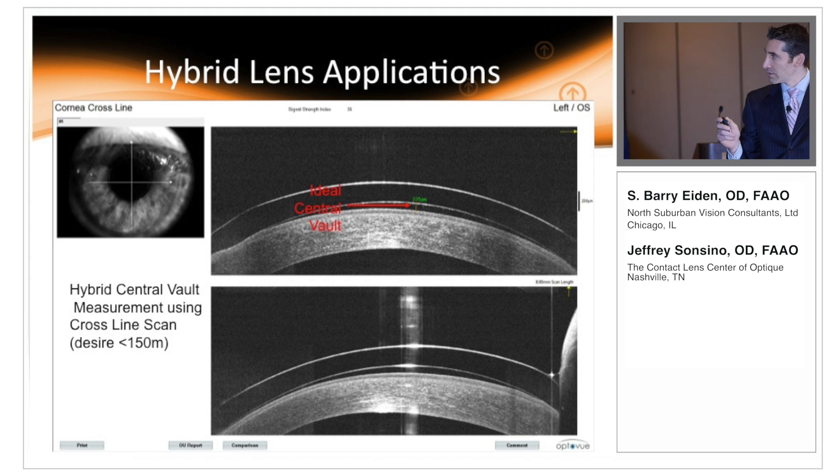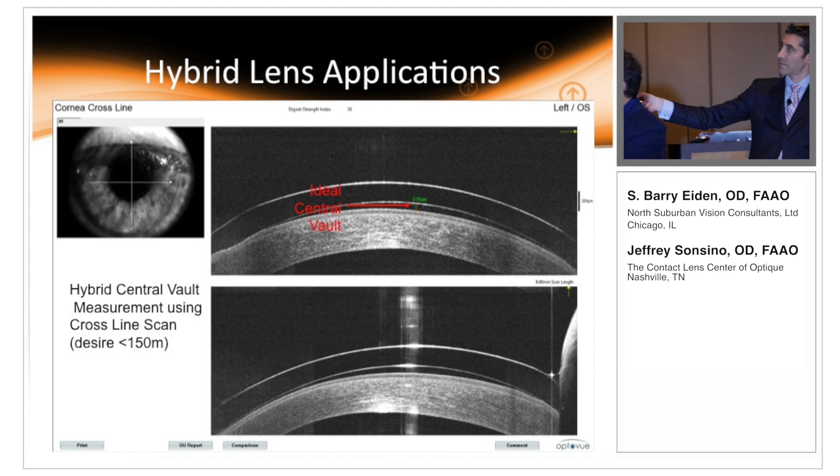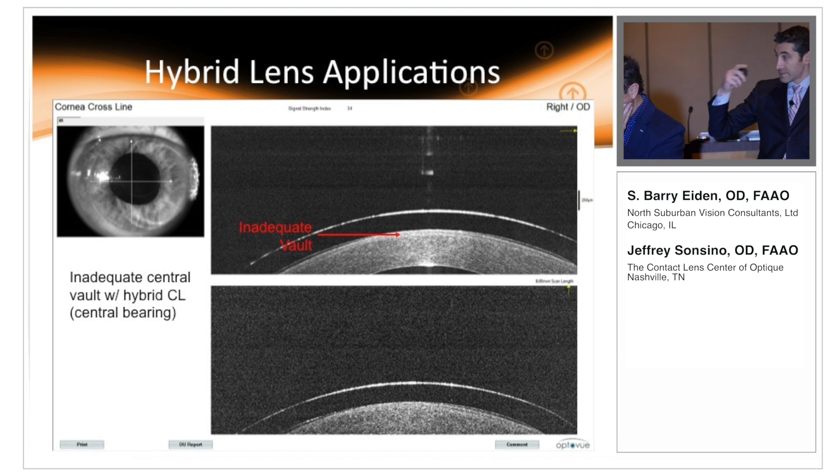Moving on to hybrids — evaluating hybrid lenses with OCT is very straightforward. Here we have a vault of 105 microns, which is the optimal vault for the Ultra Health lens. Here we have an excessive vault — the vertical line scan shows 231 microns, indicating you need to decrease the vault of the trial lens. And here is the opposite problem: inadequate central vault, where we can see a lucid interval that disappears, indicating bearing on the central cornea — confirmed in the vertical scan as well.